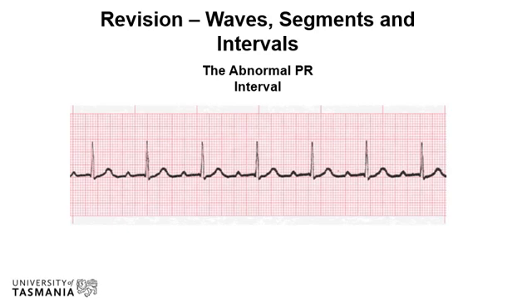The ECG on screen shows a prolonged PR interval, greater than 0.20 seconds, and this indicates an atrioventricular block. In the case of the ECG above, this is a first degree AV block. We'll discuss these more later in the semester.